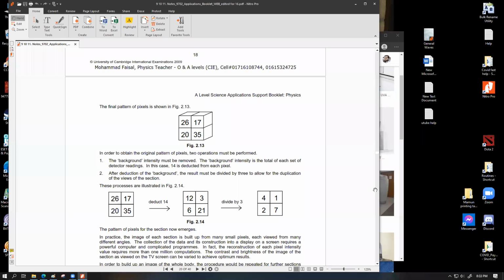We're going to do our first scan, we're going to get a bunch of numbers, we're going to duplicate that to the number of voxels that we know physically exist within that amount of physical tissue, and then we're going to do 3 more scans, with the diagonal addition to all of those, and eventually we're going to have a large amount of values for the voxel boxes.